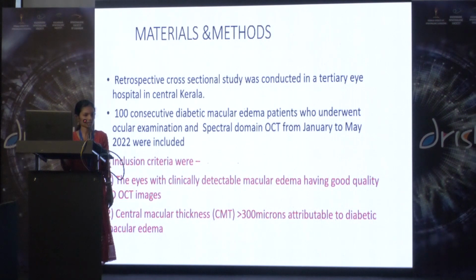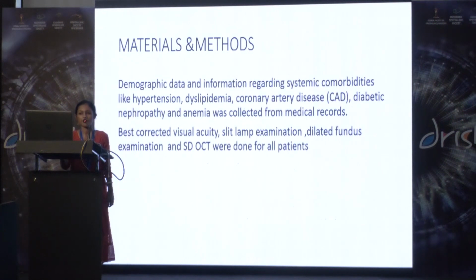The inclusion criteria were eyes with clinically detectable macular edema having good quality SD-OCT images and central macular thickness more than 300 microns, attributable to diabetic macular edema.